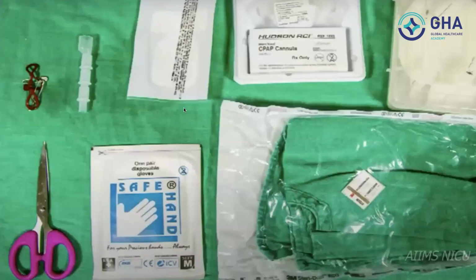In this video, we shall learn the fixation of binasal prongs for the delivery of CPAP to a newborn. Assemble the Hudson prongs of appropriate size, gloves, green sheet, scissors, rubber bands, safety pins, tegaderm, and a few connectors. Find the Hudson prongs, Velcro, and connectors in the prongs kit. Cut a strip of tegaderm.